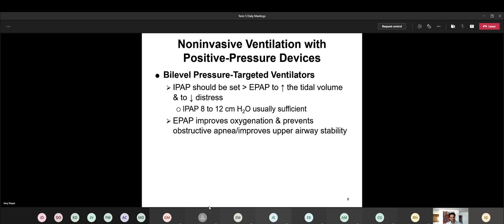And then once they titrated it to the point where you had very little apnea and hypopnea events, then they'll say this has to be your optimal settings here. And then that's what will be prescribed. And the physician will write the orders for use BiPAP at home with 12/7 or 12/6 or whatever the case is, based on what ended up happening in that sleep study.